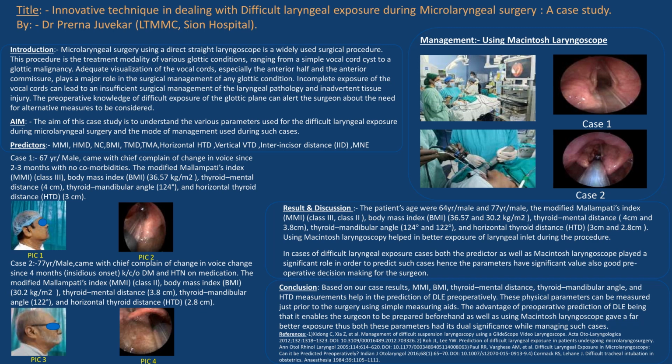The advantage of preoperative prediction of difficult laryngeal exposure is that it enables the surgeon to be prepared beforehand, as well as using Macintosh laryngoscope gave a far better exposure. Thus, both these parameters had dual significance while managing such cases.